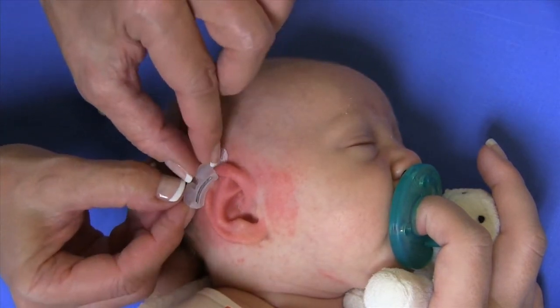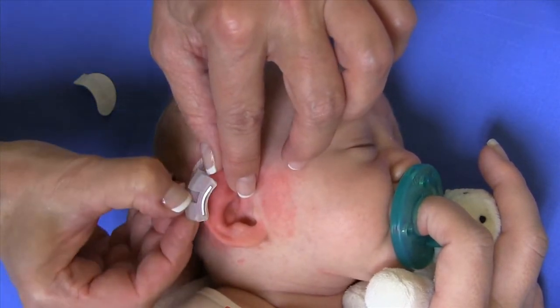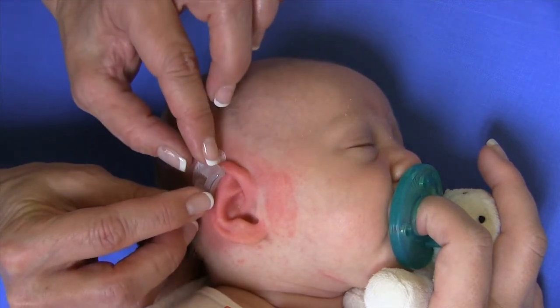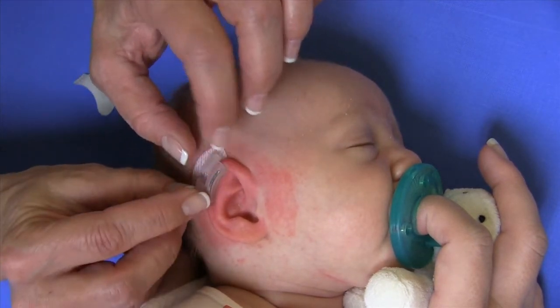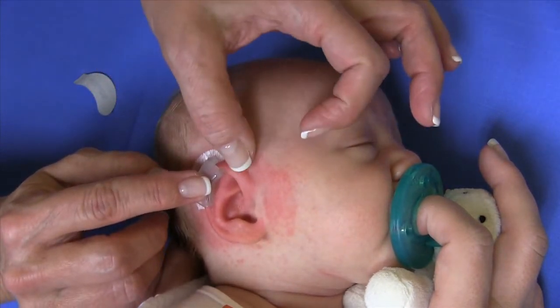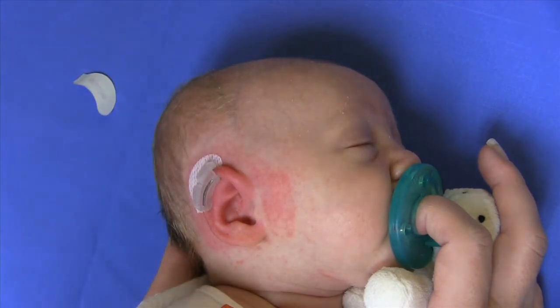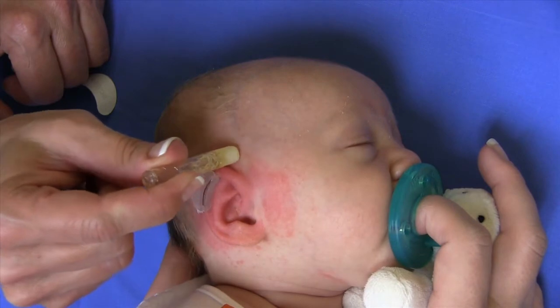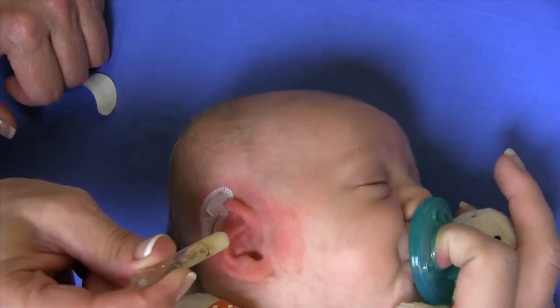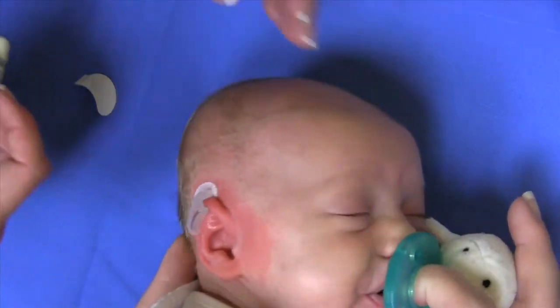I'm going to sneak that back on there so we have a little bit of pressure under there, just under the top of that helical rim. We've got that in good position and now it's stuck to the adhesive. I'm going to use a little bit of Mastisol and just lightly apply that all the way around, and then right here on the Superior Crus.